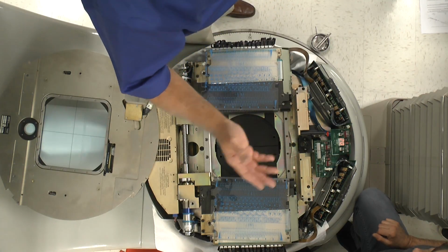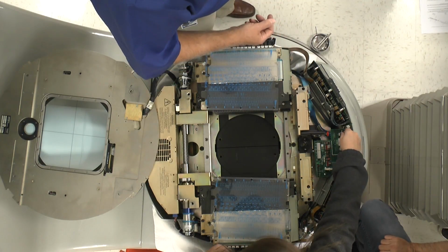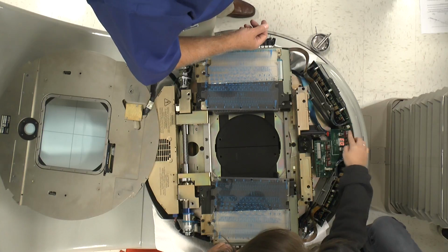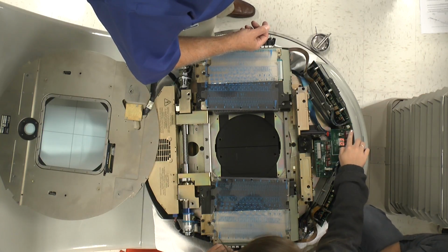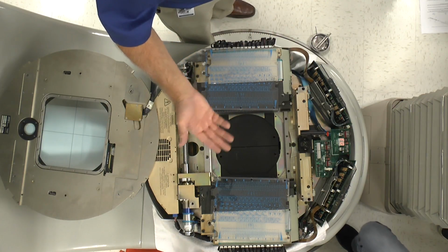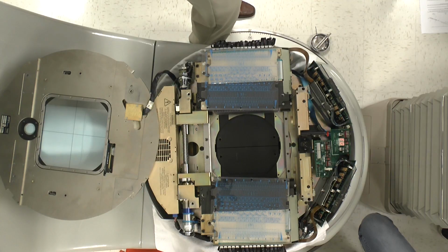Okay. And we did 3, right? Yes. So why don't you do 3? They sound different. Like normal. Normal. Okay. Different motors. One might be newer than the other. Gotcha. I did 3. You did 3?